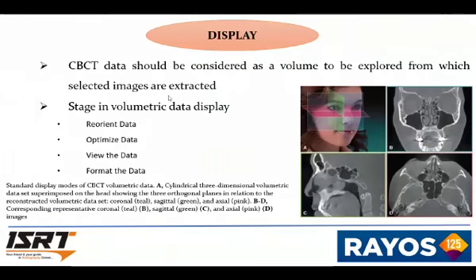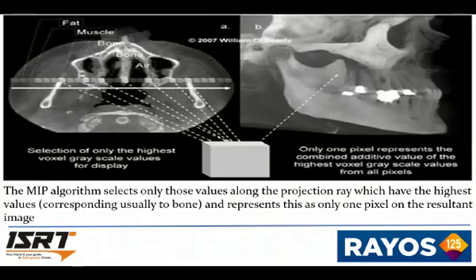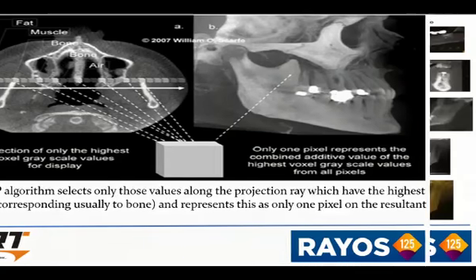So these are the CBCT images, and with a basis image, we are able to get a coronal reconstruction, sagittal, and axial reconstruction. So these are the multiplanar reconstructions done. In case of the mandible, a single projection also can be done to get the alveolar bone thickness, etc. So this is the maximum intensity projection also done, according to the different types of algorithm or software used.